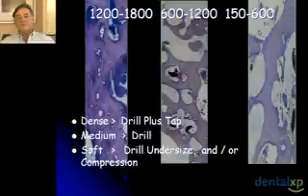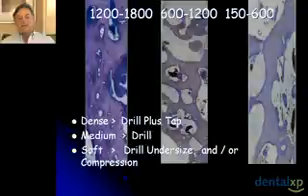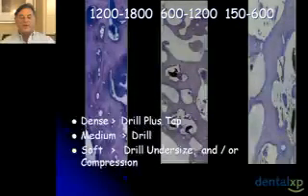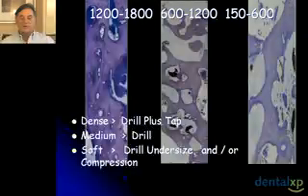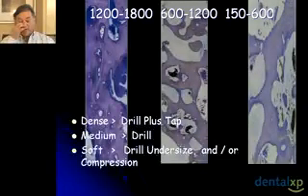This is a representation of bone density, or Hounsfield units of bone. Hounsfield units are density units that are used in radiology to describe the density of various anatomical structures. It originally came probably from tumor research, and we are incorporating it into our use in dental implants, looking at the various bone sites. I typically consider 3 surgical protocols.